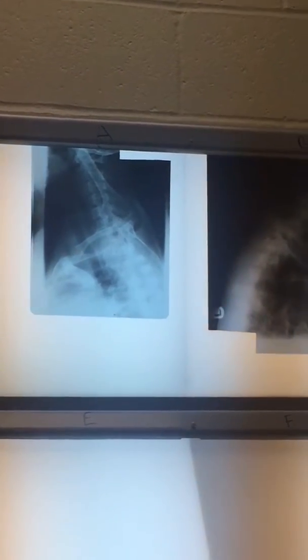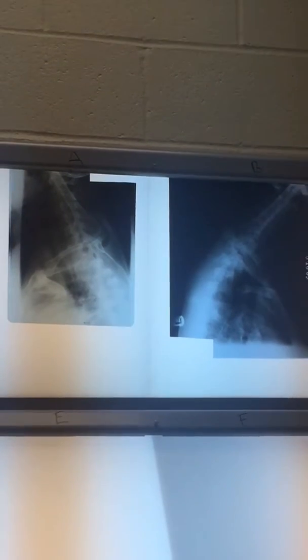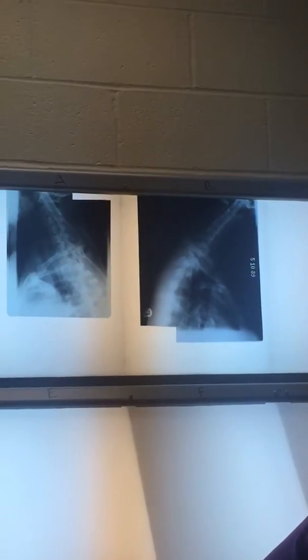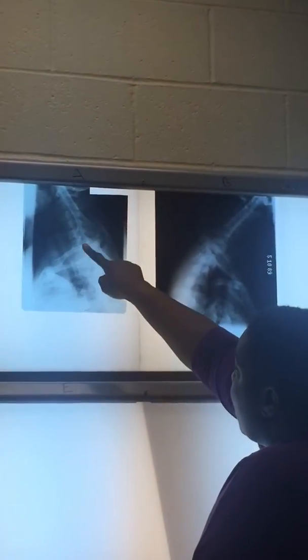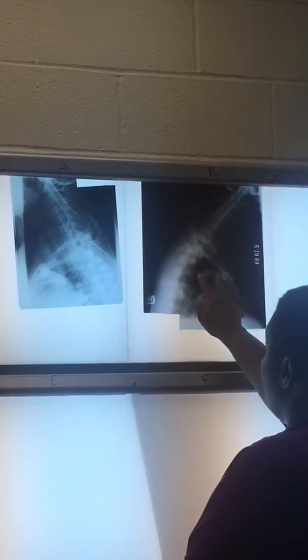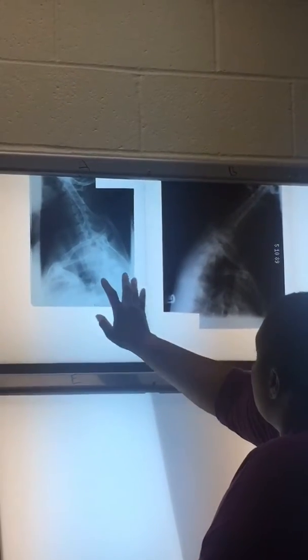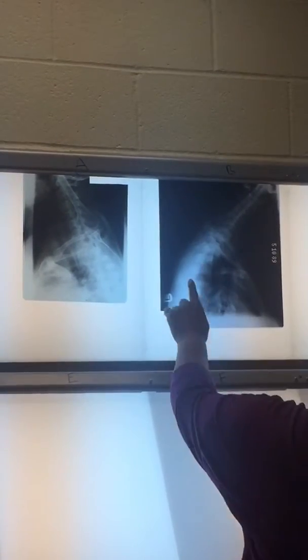The image in your book and in the PowerPoint doesn't quite have the upper cervical spine, so use the elevated clavicle as your ballpark for locating C7-T1. The elevated clavicle is this one here, and the non-elevated clavicle is this one, coming across here. Those striations you see are ribs.